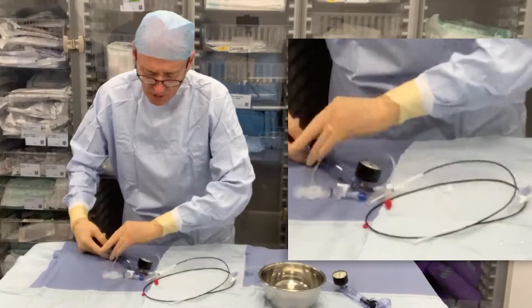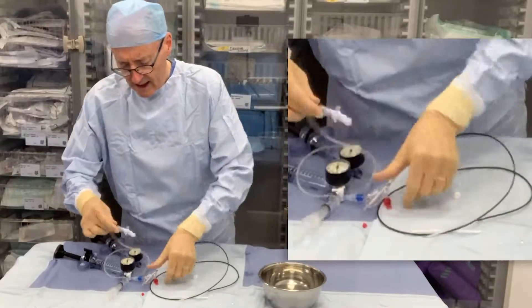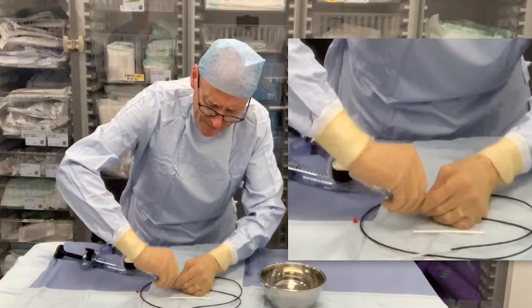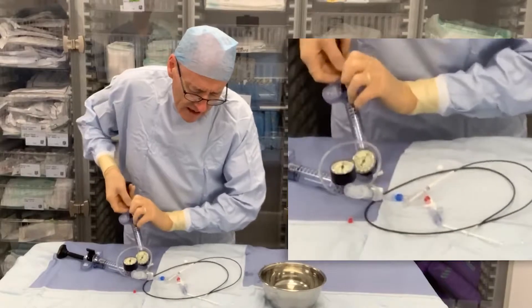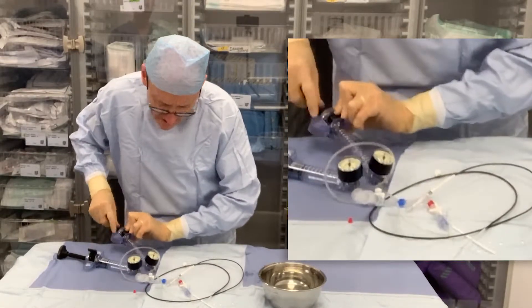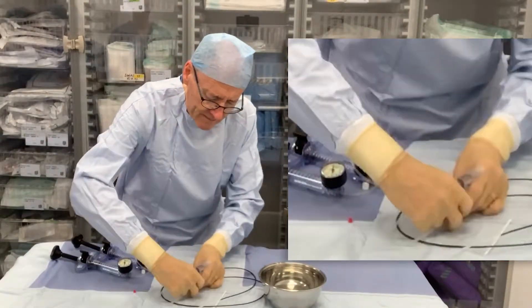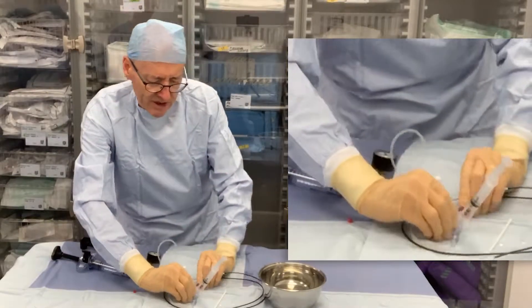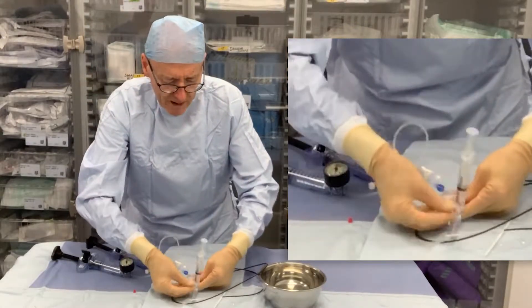The outer balloon — you can see this effect more obviously. So again connecting the end deflator. It's usually a one in four contrast saline mix. So again pull, pull negative. Now that we have negative, you'll see how much will actually drop in when we open it.